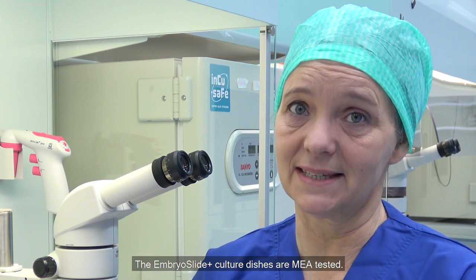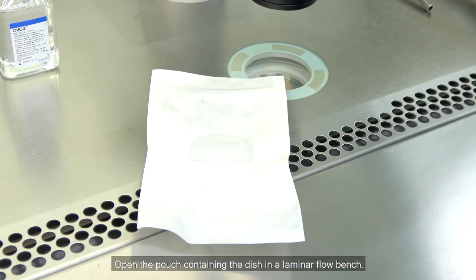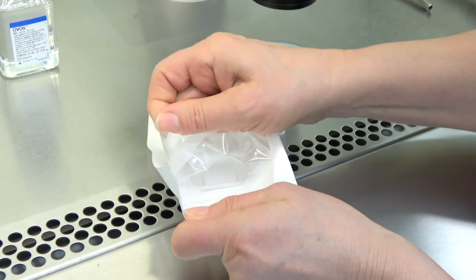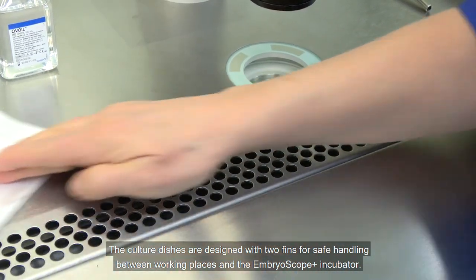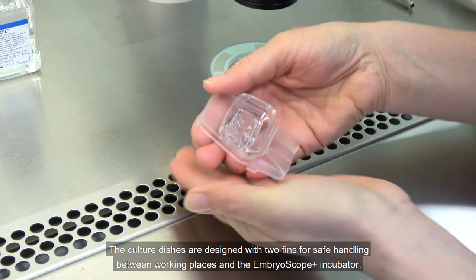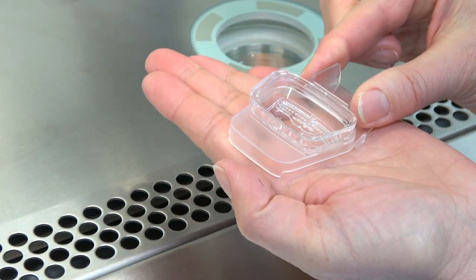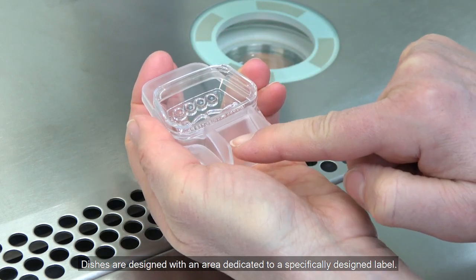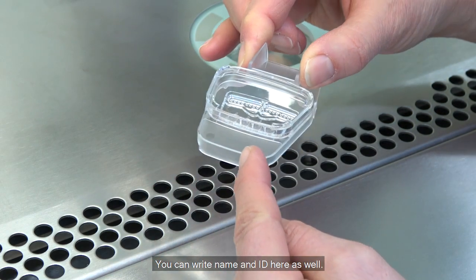The EmbryoScope Plus dishes are sterility tested. Open the pouch containing the dish in a laminar flow bench. The culture dishes are designed with two fins for safe handling between working places and the EmbryoScope Plus incubator. Dishes are designed with an area dedicated for a specifically designed label, and you can write name and ID there as well.